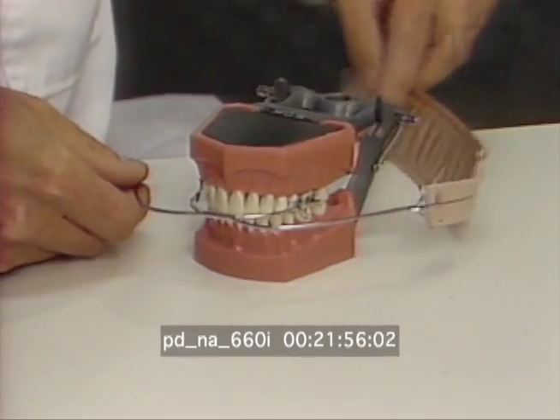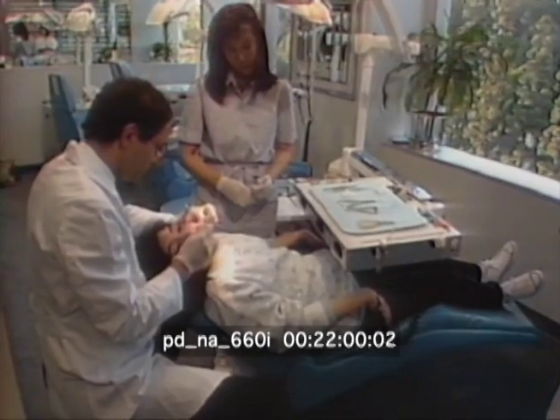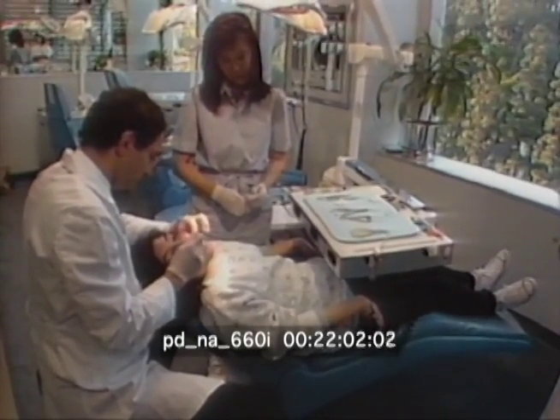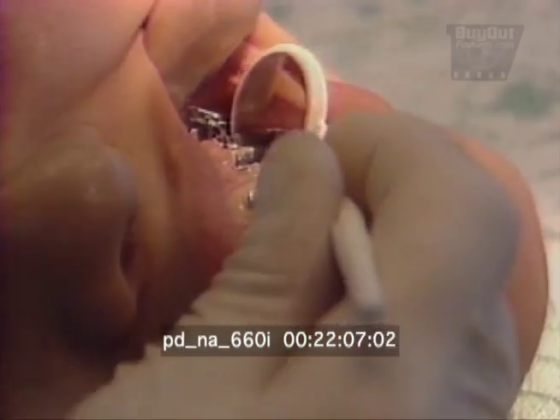Traditionally, alternatives like rubber bands or headgear move the back teeth, but many teenagers and adults simply don't wear them, which lengthens the treatment. The magnets work by themselves, and orthodontists believe their use shortens treatment time.